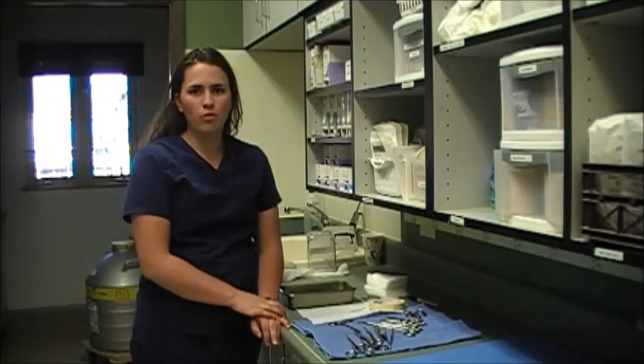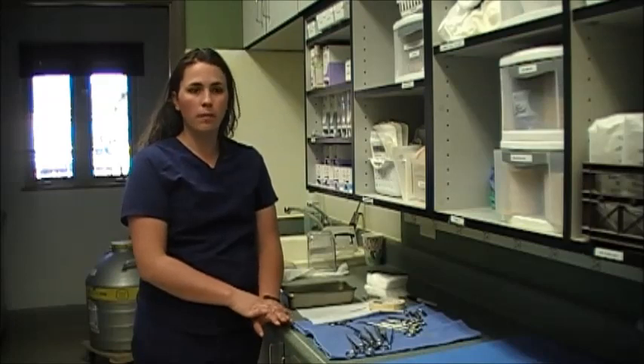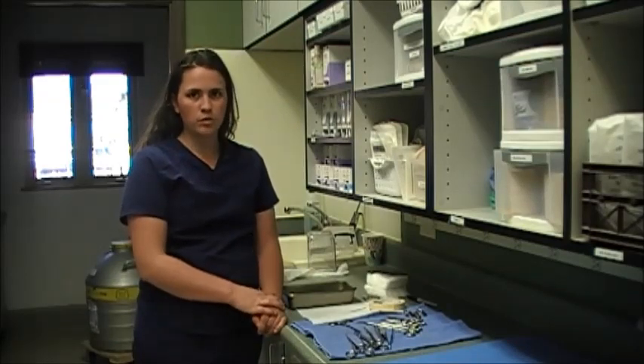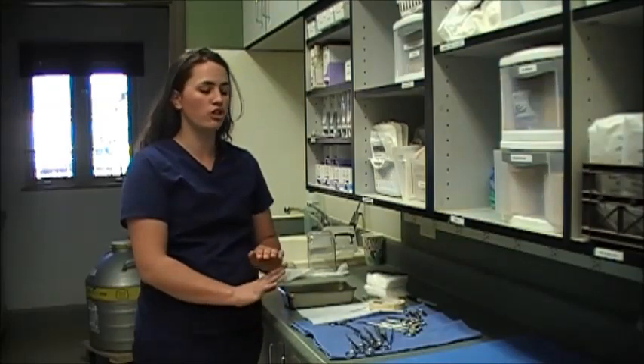What I'm doing right now is assembling and wrapping a surgical pack. The pack I'm going to wrap right now is just our general pack that we would use for our basic procedure. For any specialized procedure we have individual wrapped tools that we would also grab. This is just our general pack.